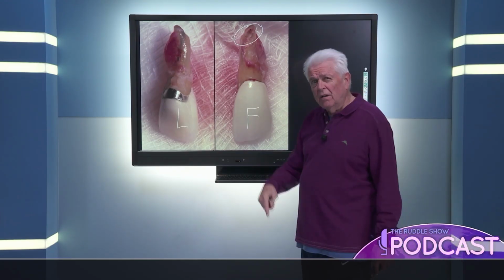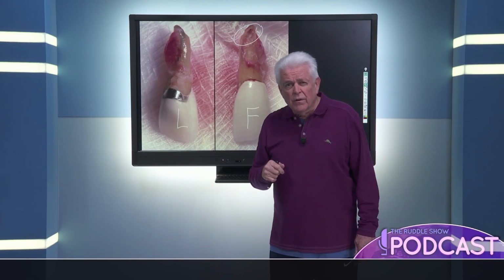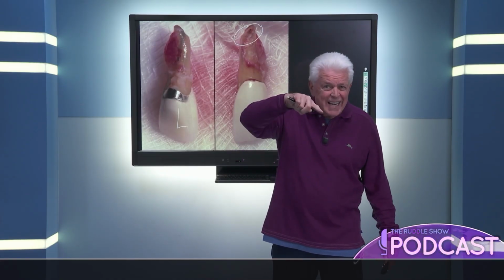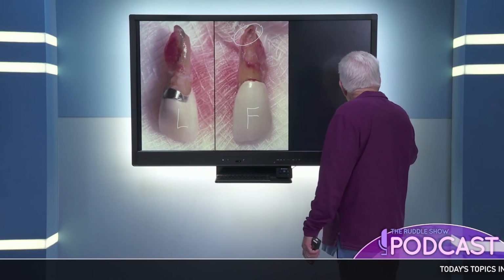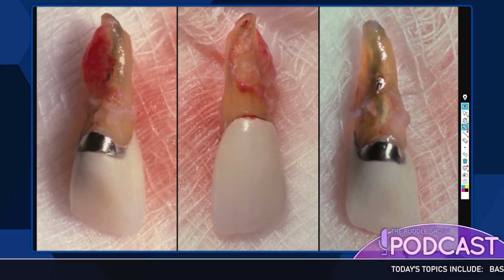Remember the film I said? I said, look, it looks pretty good, right? So a lot of you look at those films and you go, gee, I don't know why they're hurting. I tap on the tooth, it's fine. The x-ray shows intact PDL, but a lot of times it isn't what you see. Remember, there's the world you see and there's the world that is, and they're not the same. Not always. And then here is just flat out straight lingual. So this was lingual, but it was a little bit off axis.